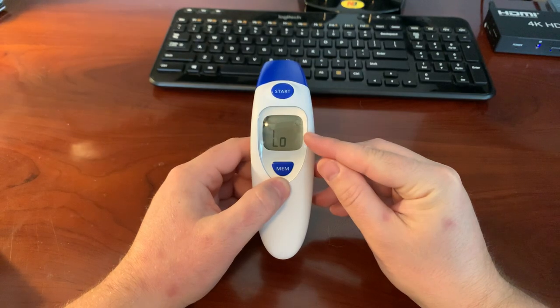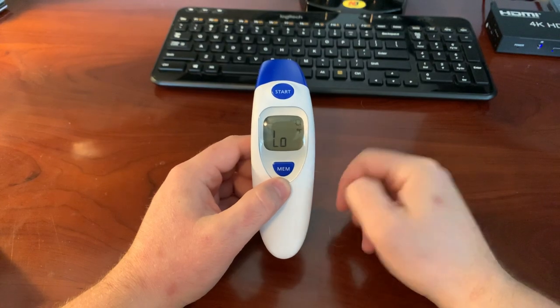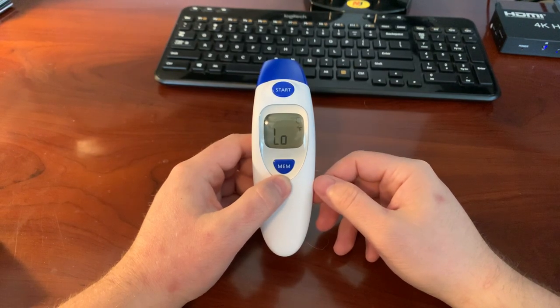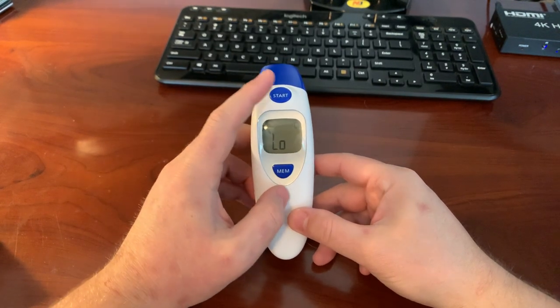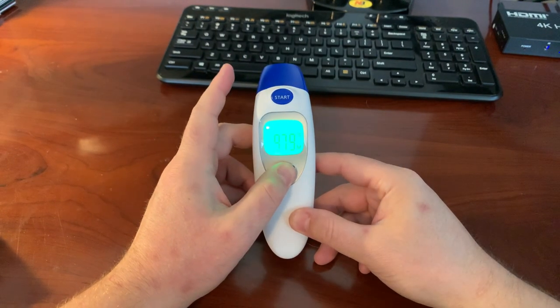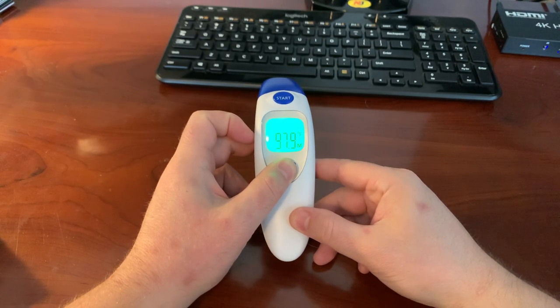How do you change the units from Celsius to Fahrenheit? So I changed them to Fahrenheit, but say it was at Celsius and I needed to change it back. What you need to do is let this thing pretty much completely boot down, or just hold the memory button for a couple seconds and it'll shut off.